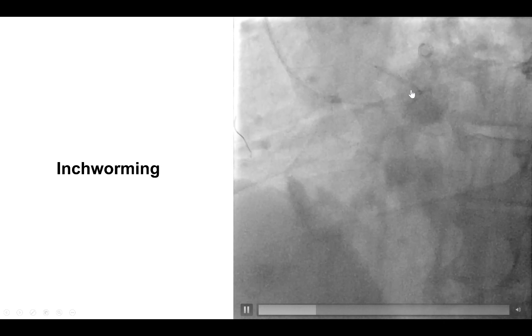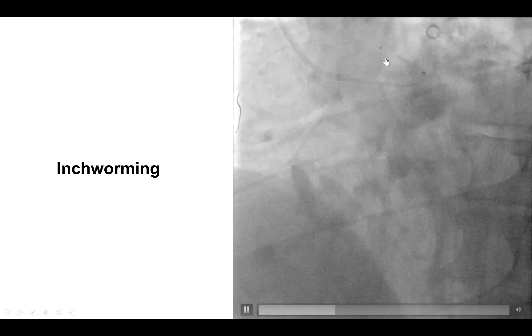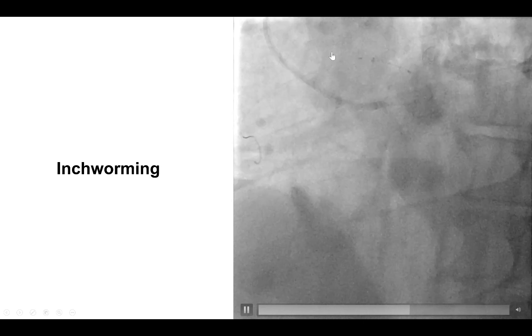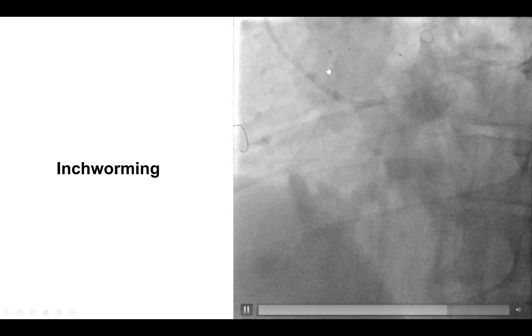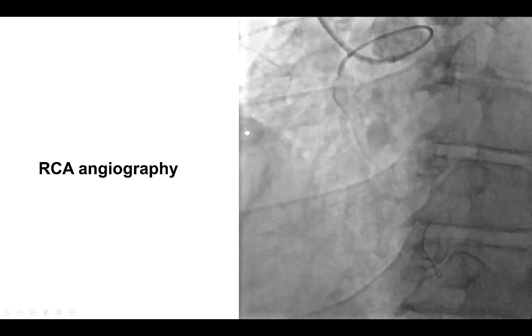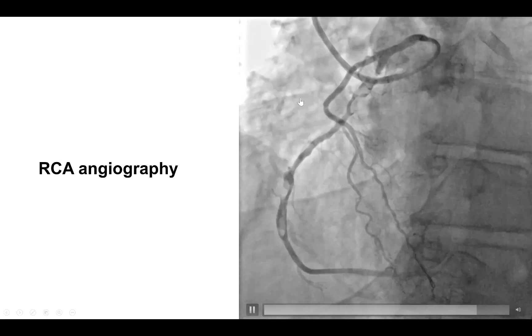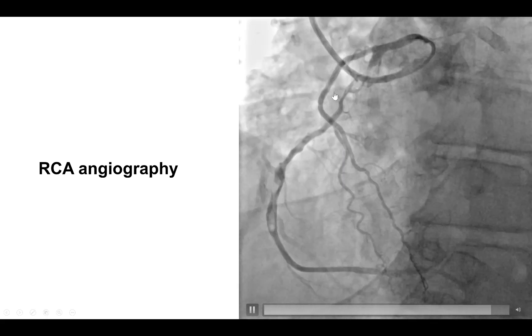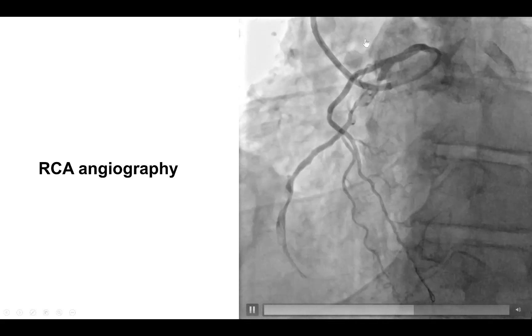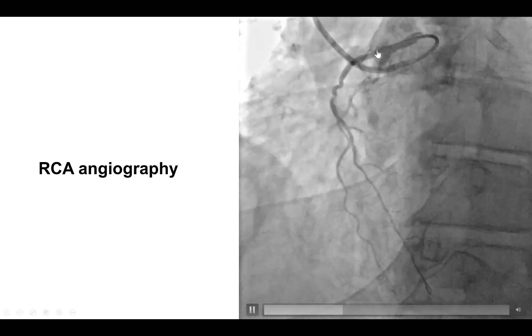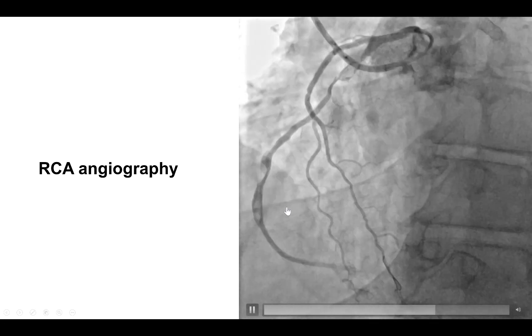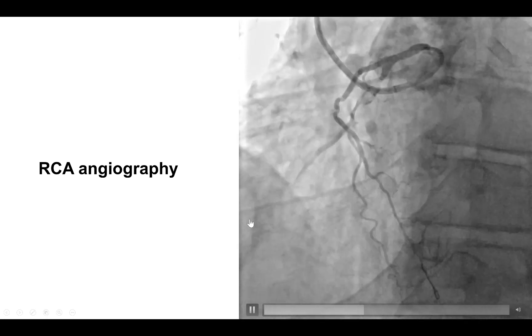To advance the guide extension further, we used the inch-worming technique with a small balloon being inflated, then deflated, which helped advance the guide extension further into the right coronary artery. Here is an angiogram through the guide extension — we are indeed in the acute marginal branch, but we can now visualize the right coronary artery and see the significant lesions in the proximal as well as the mid portion of the vessel.